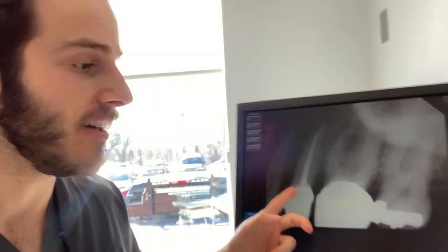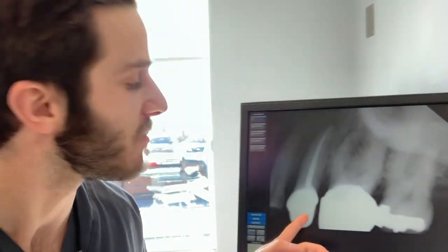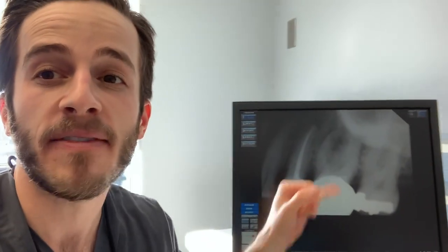So sometimes dental diagnosis is really hard. Just have this patient come in. Now this patient, previously a long time ago, had a root canal completed on this tooth right here, upper left first premolar, and a crown on his upper left first premolar and his first molar. Patient's complaining of having pain in his upper left jaw. Now, clinical presentation, I look in the mouth, you can see almost like a little pimple above the area, almost in between the premolar and the first molar.